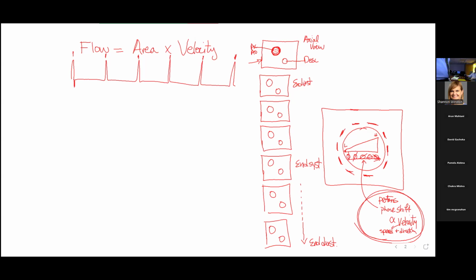So what we're going to actually do is take these phase encodes and we're going to make two of them. Okay, so they're going to actually be in pairs. And one piece of information is going to be sensitive to motion, and the other one is going to be insensitive to motion.